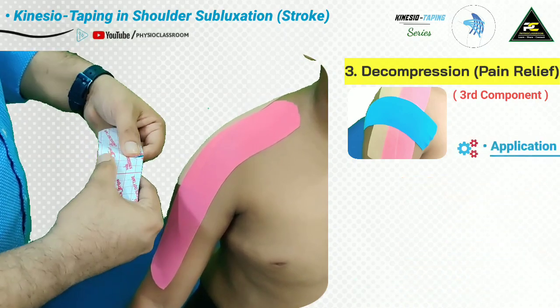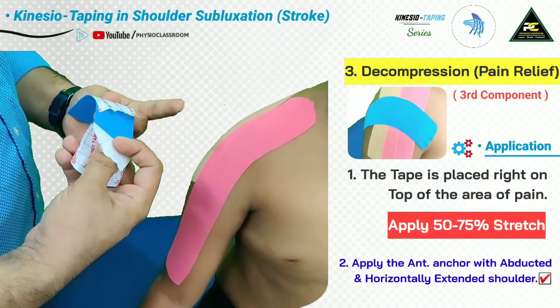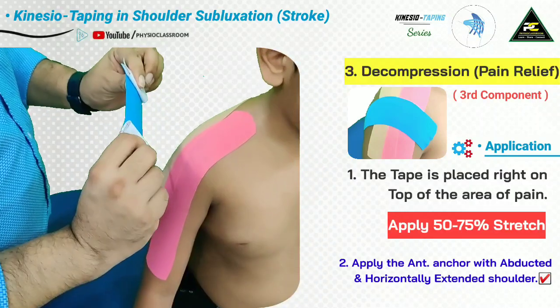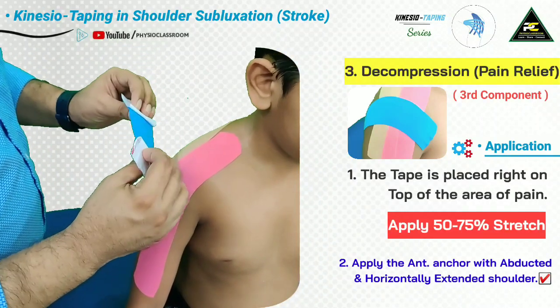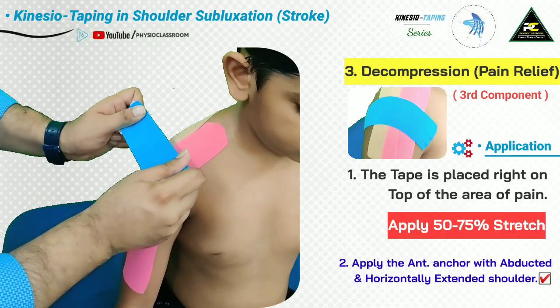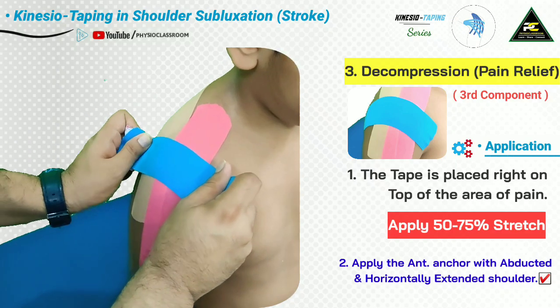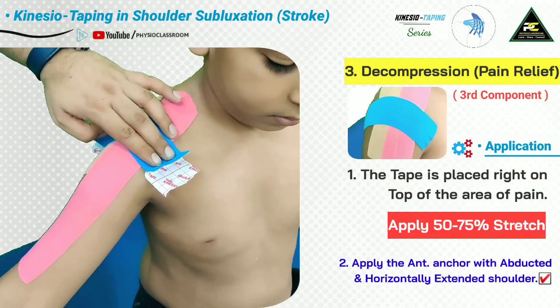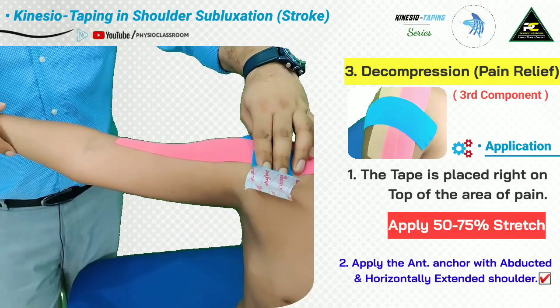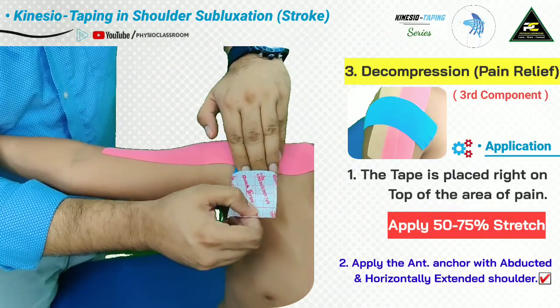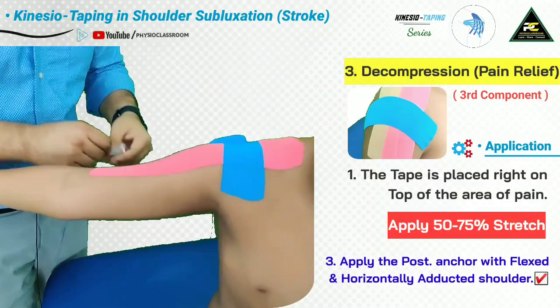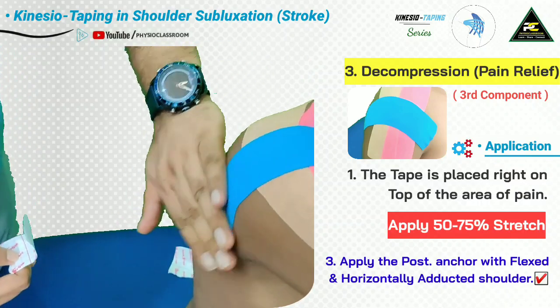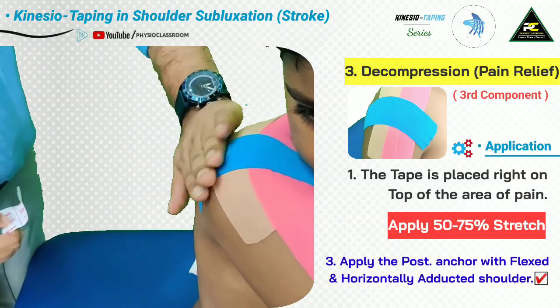Tear the strip from the center, then remove the paper backing toward each end while holding both the distal and proximal anchors. While holding the paper backing at each end, stretch the tape by around 50 to 75 percent and place it right on top of the area of pain. To apply the anterior anchor, ask the patient to abduct and horizontally extend the shoulder, then apply with no tension. Similarly, the posterior anchor of the I-strip is applied by asking the patient to flex the shoulder and horizontally adduct — no tension on either anchor.